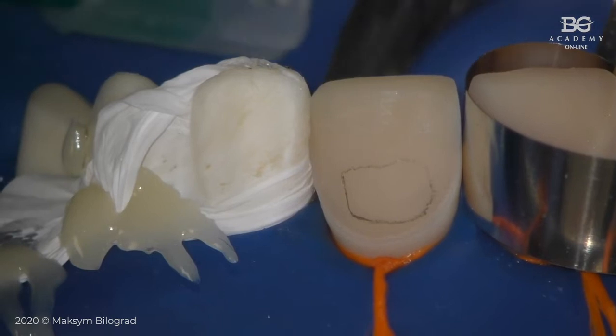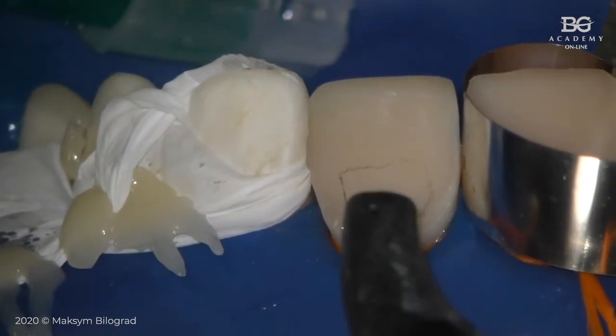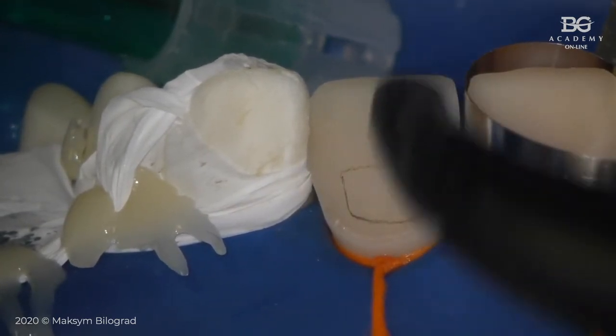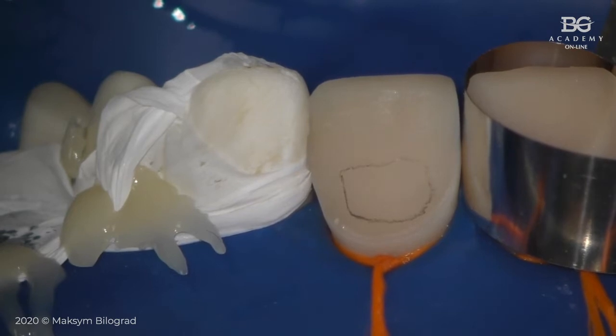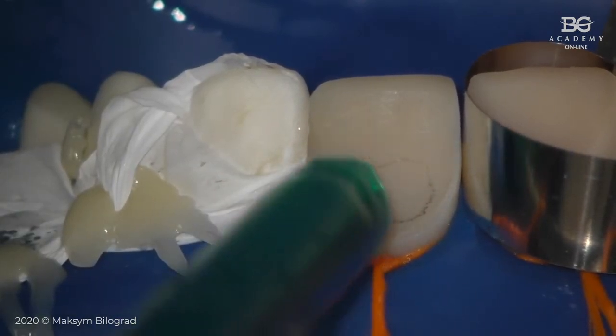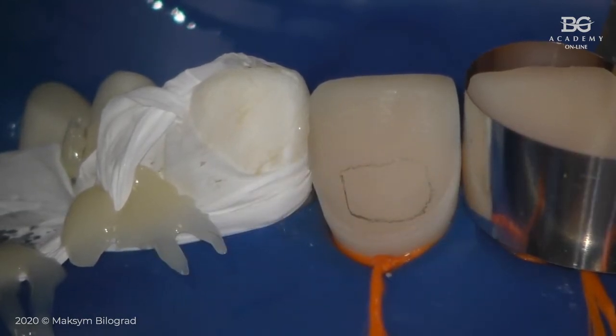Then I'm drying from palatal surface. Then I'm drying the tooth, but from enamel, so not directly, but just this way. And then I'm taking my suction without cover and just take some moisture straight from the tooth surface, okay?